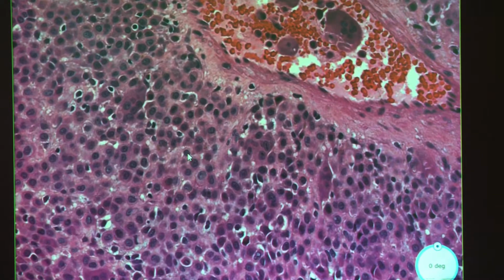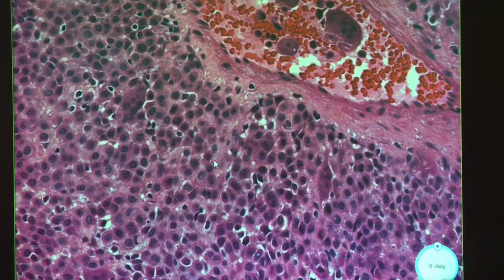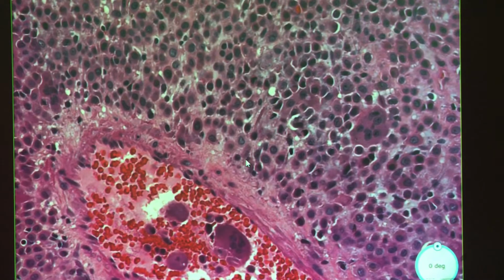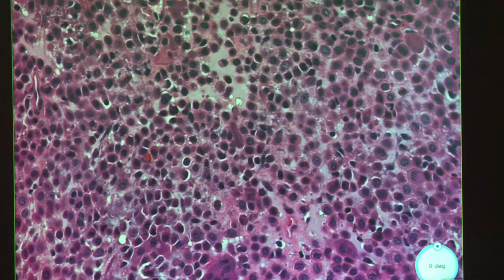The nucleoli are somewhat inconspicuous. This is as high as I can scan in, but they're not super prominent. Like there's maybe one, there's one. The cytoplasm is very eosinophilic. Some of them look like maybe they have, like this one looks like it has 2 nucleoli. What else we got? Yeah, it's definitely a giant cell. And then we have this sort of chondroid type matrix going on.